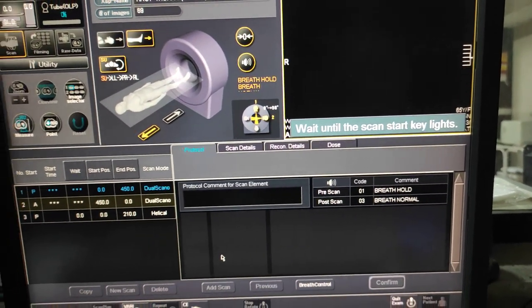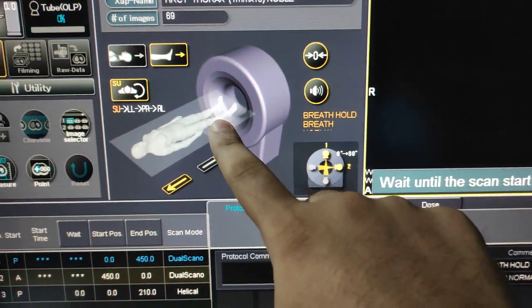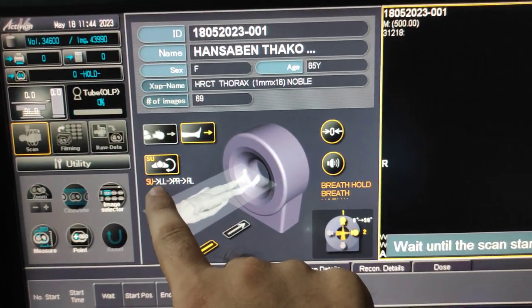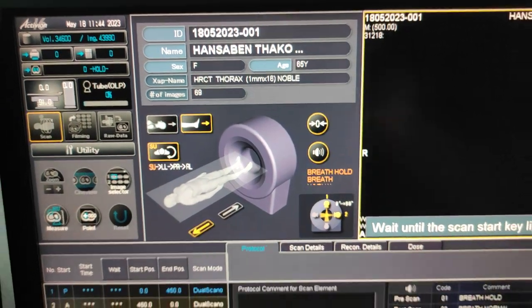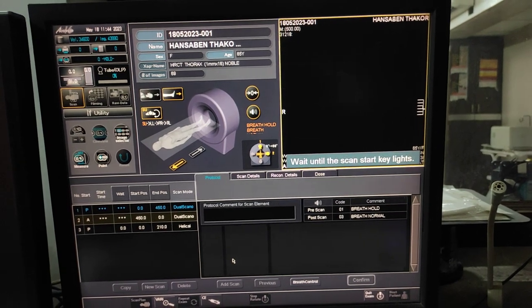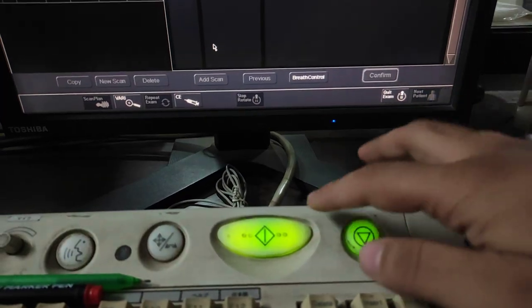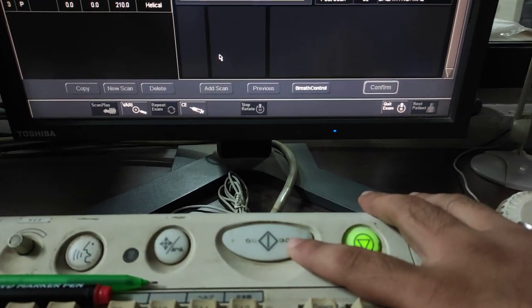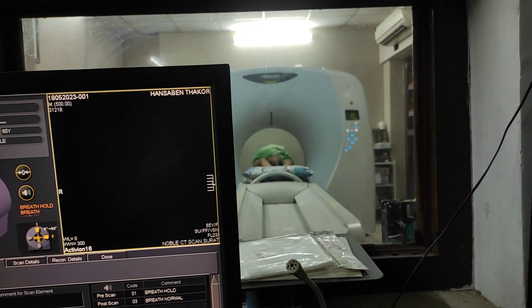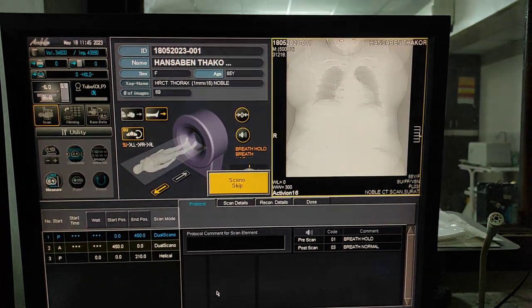Wait until the scan start key lights up. Here you can check the patient position — it is feet first, and you can change it from here as well. You have to click two times. Inform the patient to hold their breath properly while taking the scan, otherwise there will be a lot of motion artifacts.